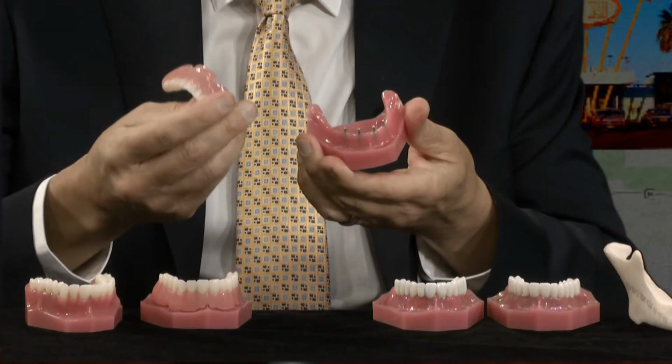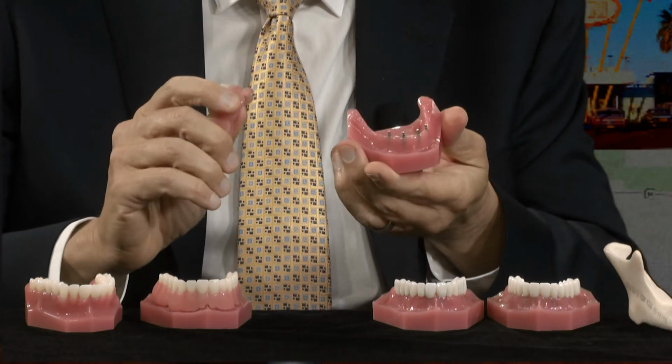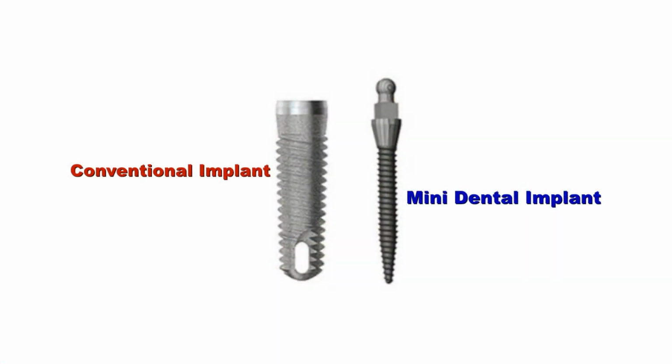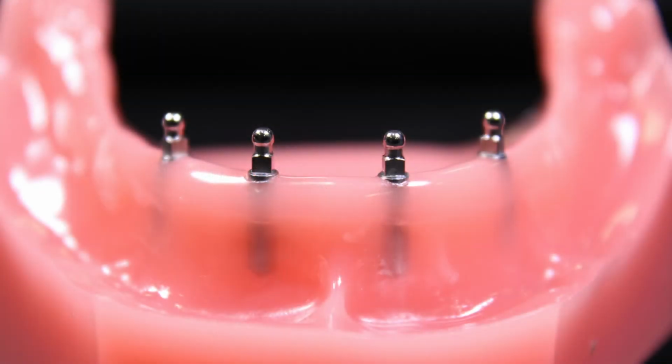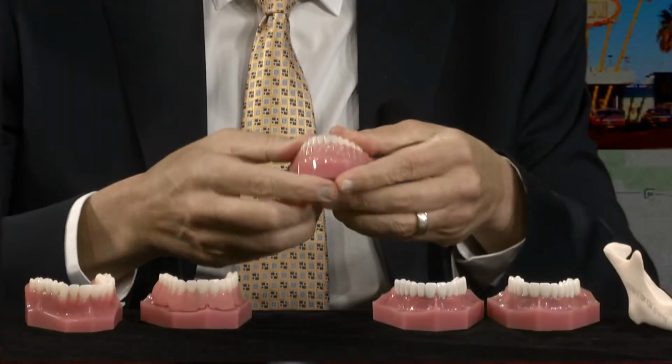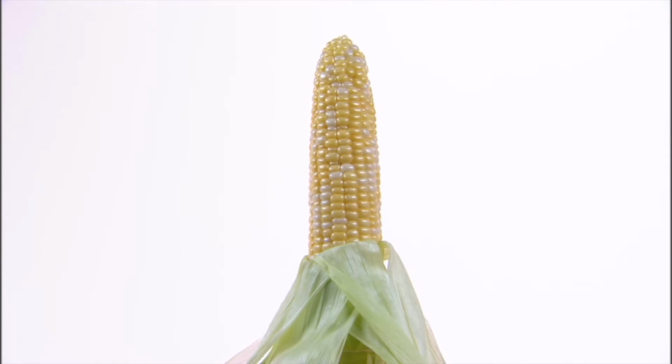We placed 4 mini dental implants in her lower jaw. And those are titanium posts. They are. Mini refers to the diameter. They're narrower than conventional implants. And they get placed right through the gum into the bone. And we make a lower denture, and it literally snaps on. And once it's on, it is solid in place. Patients can eat what they like. They can eat an apple, they can eat corn on the cob, they can eat whatever they like. This is a really nice, cost-effective alternative for people that gives them the security, and they can get rid of the goop, like you said.